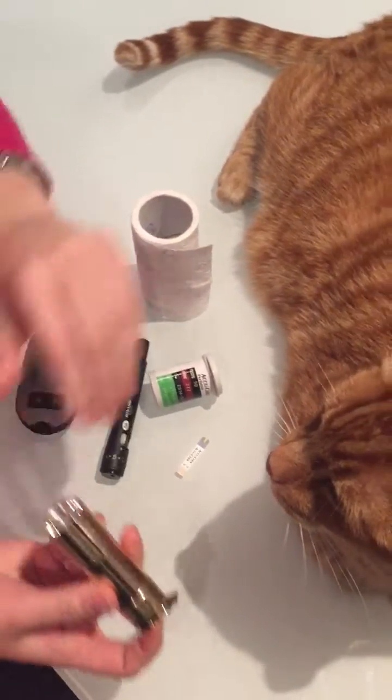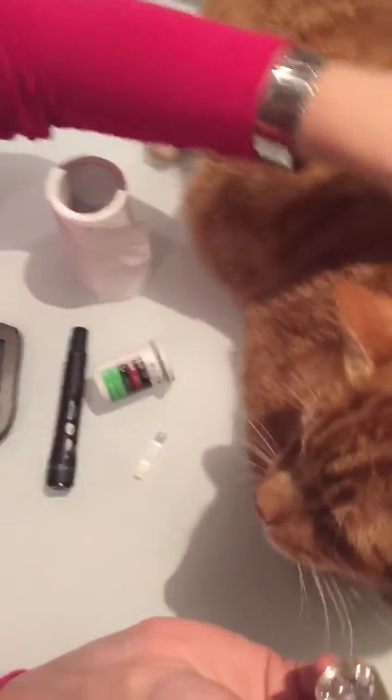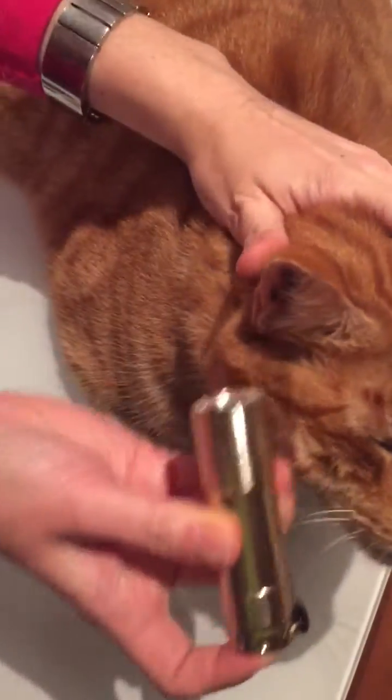So first I'm just going to quickly show you the sweet spot. The sweet spot is the part on the ear which is just on the outer rim. You can see where that red vein runs.